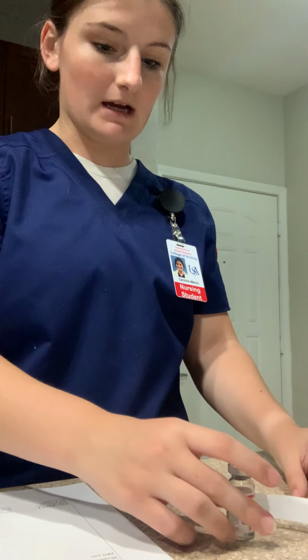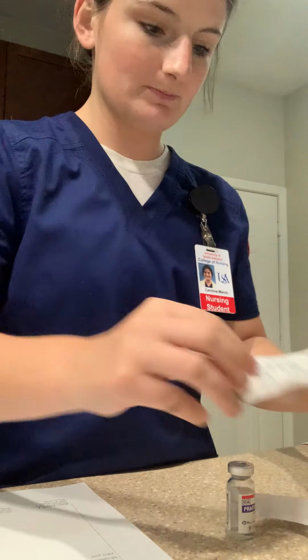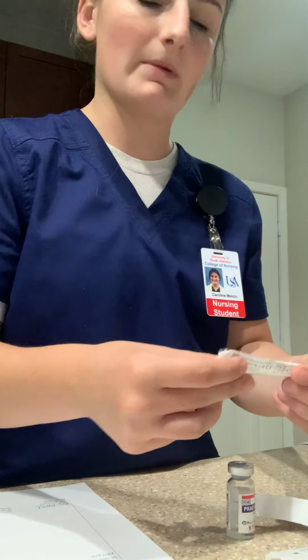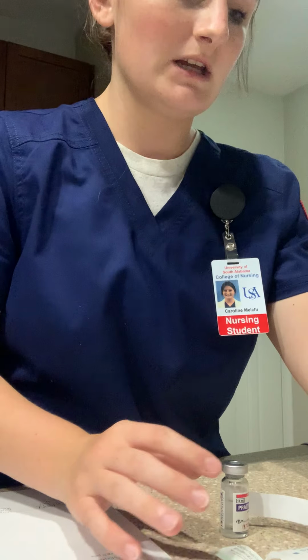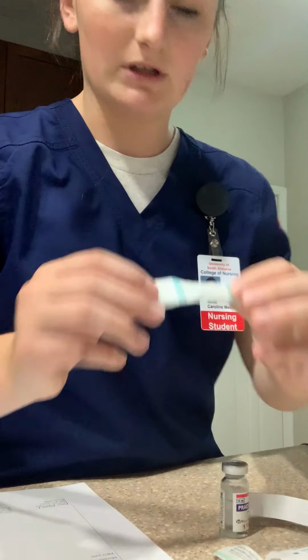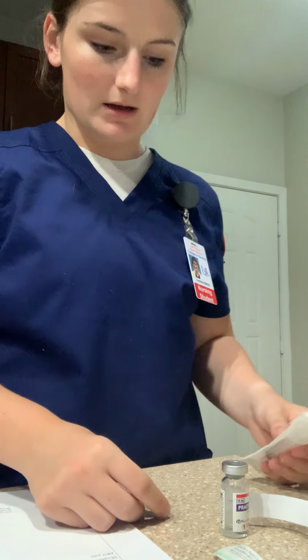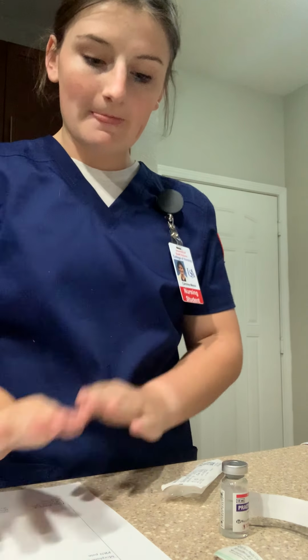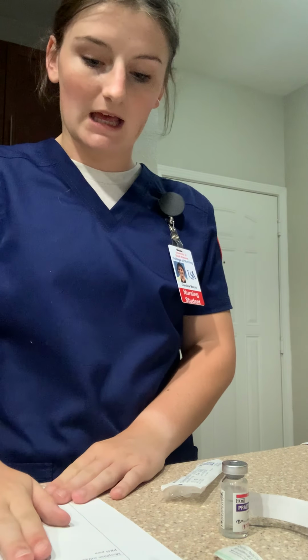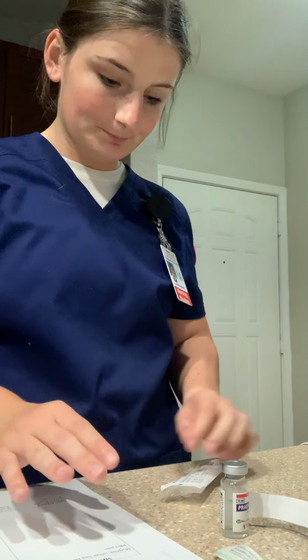So I'm going to put that to the side. Since I'm doing an intramuscular injection, I will be using a 3 milliliter syringe, and I will start by using a blunt cannula to retrieve my medication, and to inject my medication, I will use a 23 gauge needle. So I'm going to start by, again, verifying the time that it has not been given in the last 4 hours. It will be 5 milligrams, and it is morphine sulfate.